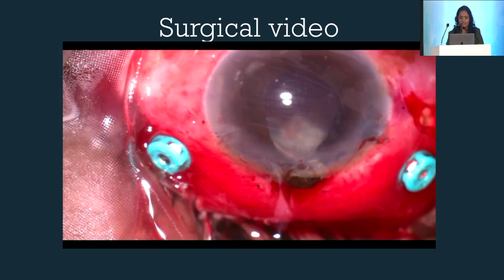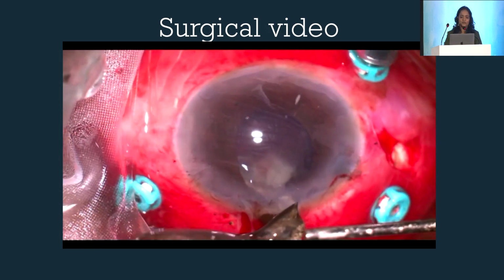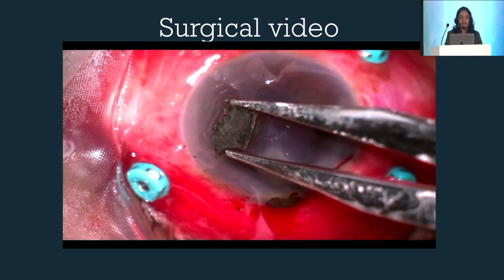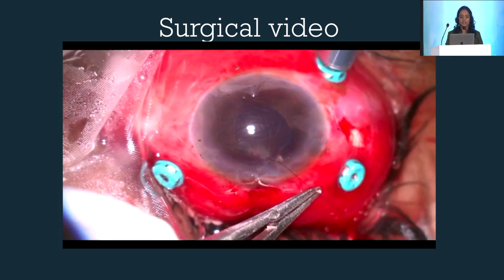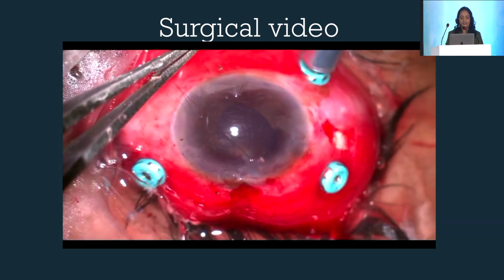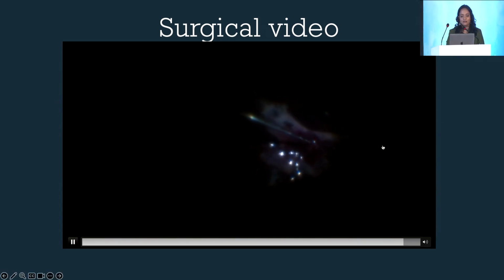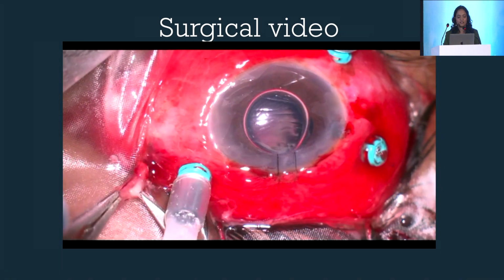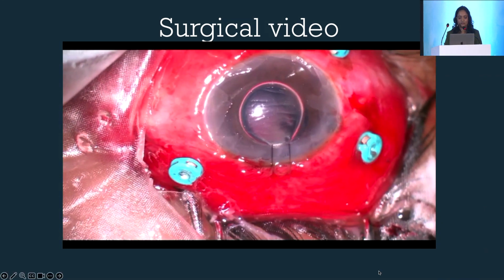So this was a very challenging case with incarcerated retina which was extruded, and we had to cut it flush with the sclera first, then go inside, remove all the exudates, and then find that the retina was having a 360-degree giant retinal tear with necrotic retina. And I couldn't save this eye. I just did an FAE and came out, hoping that at least this patient didn't undergo an evisceration.